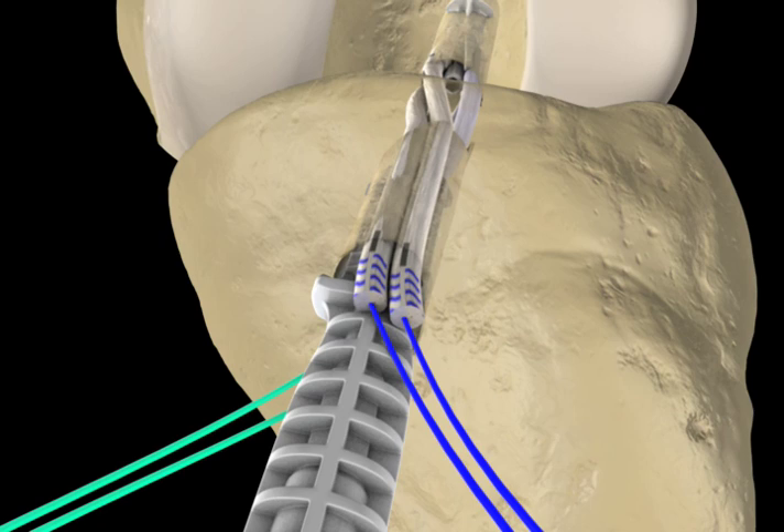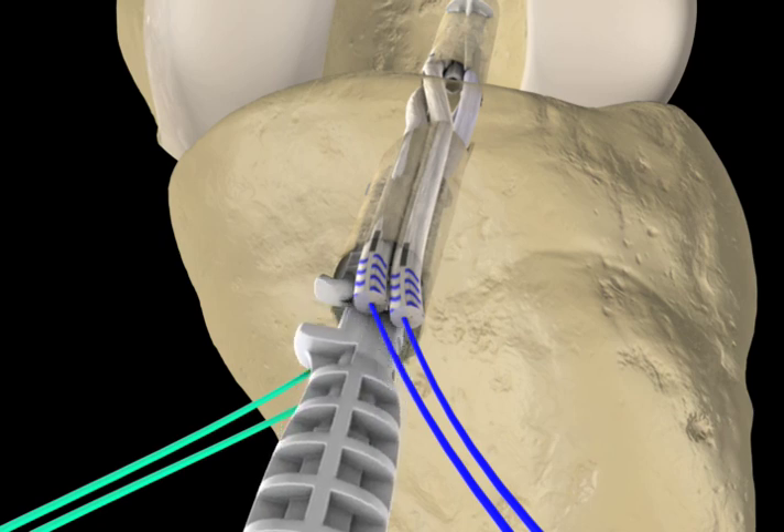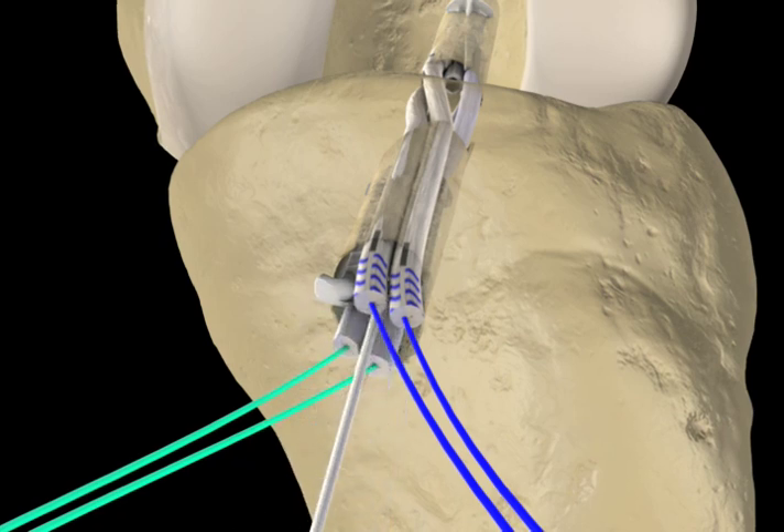Or 3 o'clock in a right knee when rotating the bundles to be anatomic. Once the cortical engagement tabs are fully seated against the tibia, disengage the inserter and sheath holder by pulling back the inserter along the guide wire.